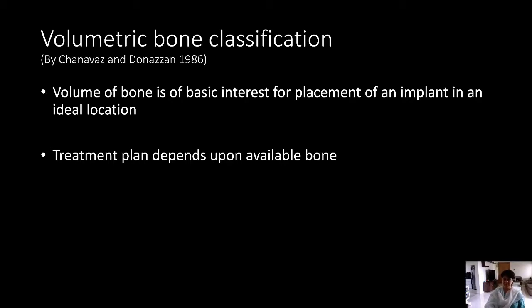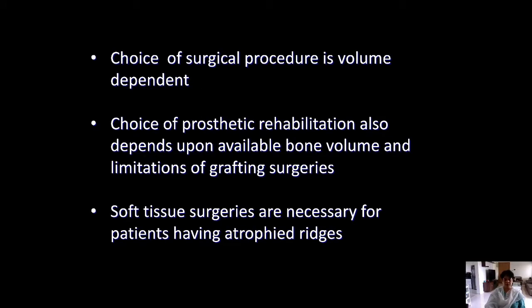Unless you have a good quantity of bone, your implant placement is not going to be in an ideal location. The entire treatment plan depends on the available bone. All of you will agree on this point that choice of surgical procedure is volume dependent. Choice of prosthetic rehabilitation also depends upon the available bone volume and limitations of grafting surgery.